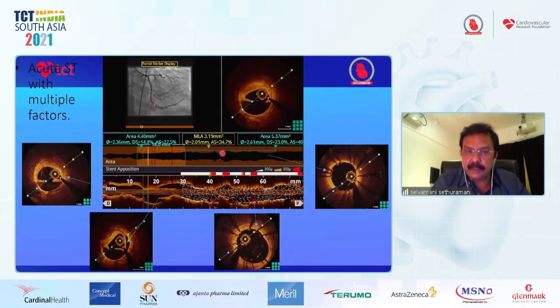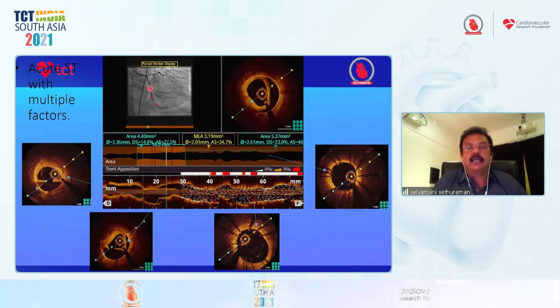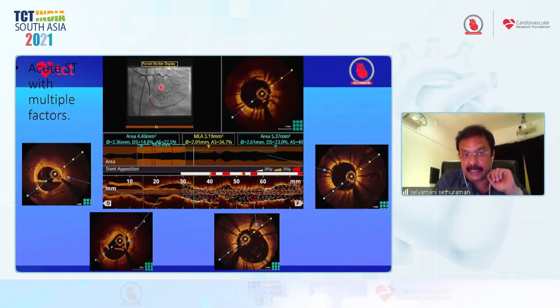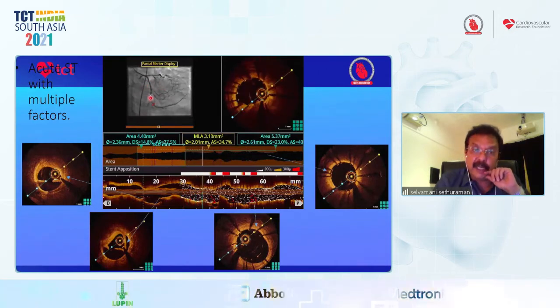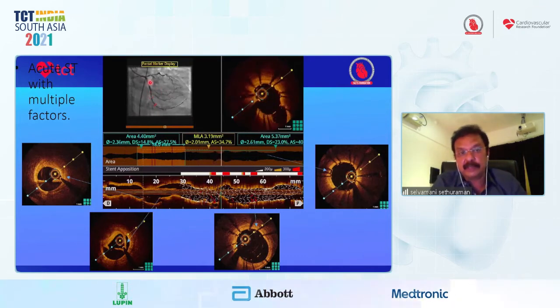And this is a very interesting case treated by one of my friends. This patient was stented for a non-STEMI, probably in the circumflex area as the culprit vessel. He also had a reinfarction in that area almost 10 to 12 hours after the procedure.